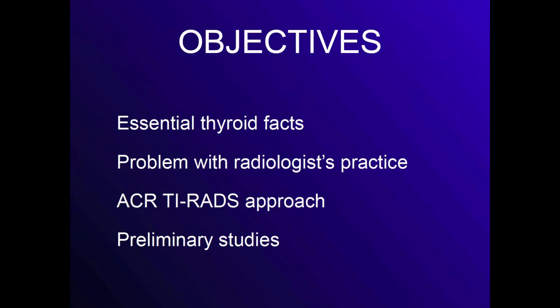In this talk, I aim to tell you about essential thyroid facts that I learned as a neuroradiologist that has actually kept me going on this problem, that makes me passionate about addressing this problem. I'm going to talk about the problem with our current practice, and then I'm going to give you a really practical overview of ACR TI-RADS, how to approach it as a sonographer as well as a radiologist. And then I'm going to share with you some preliminary studies that haven't been published on ACR TI-RADS to convince the people who are saying, I don't want to change, what I'm doing is fine. You need to change, it could be better.